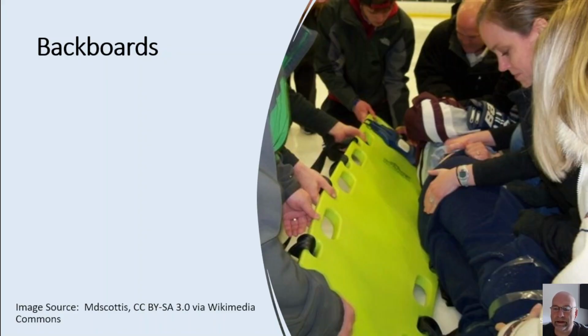If a patient is suspected to have sustained a neck or back injury, the providers will log roll the victim as a unit onto their side so the board can be placed behind them. The patient is then carefully rolled back onto the board without aggravating their injury.